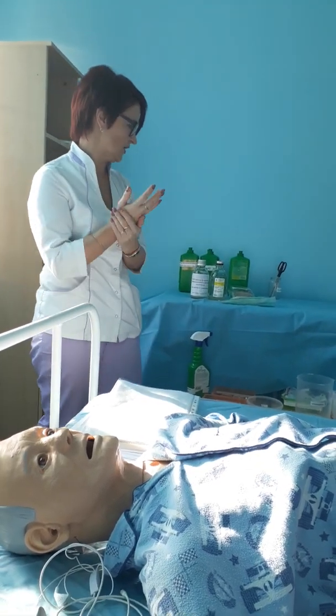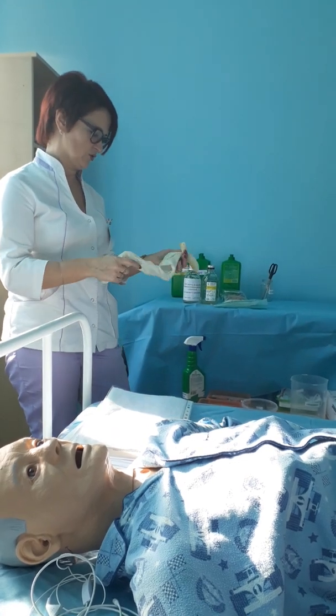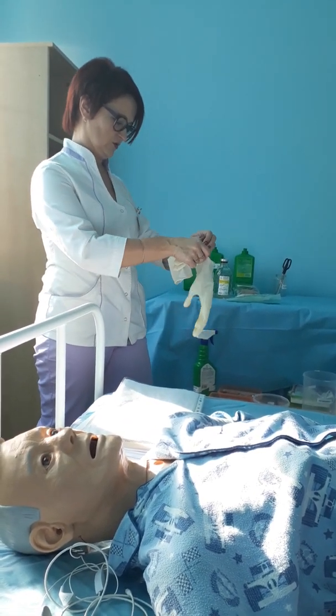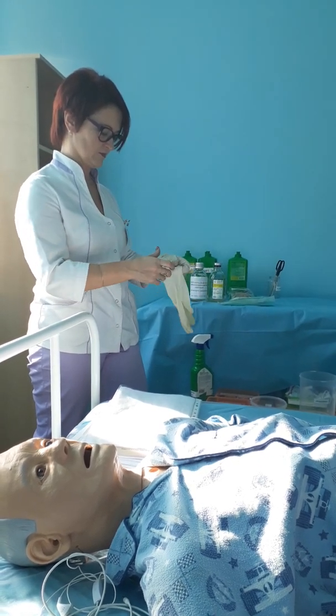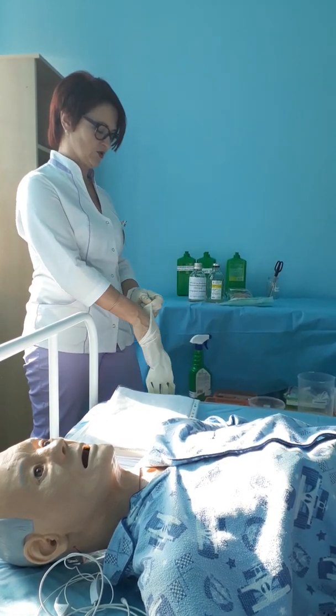Afterwards, you remove and dry your hands. Put on your non-sterile gloves and continue your work.